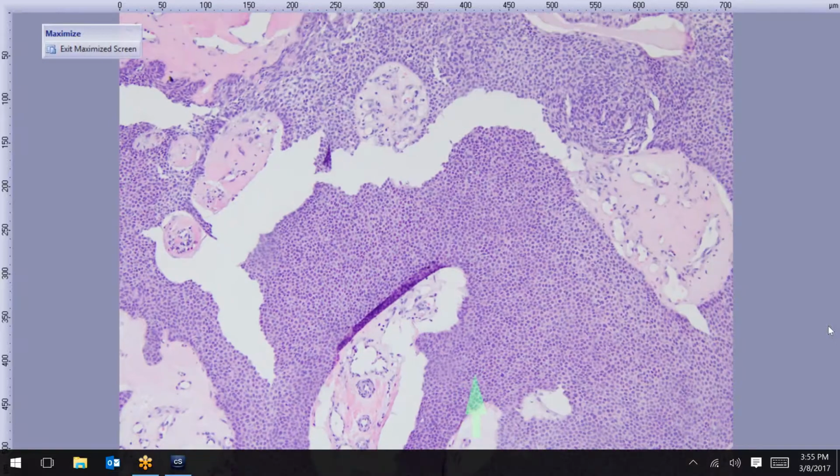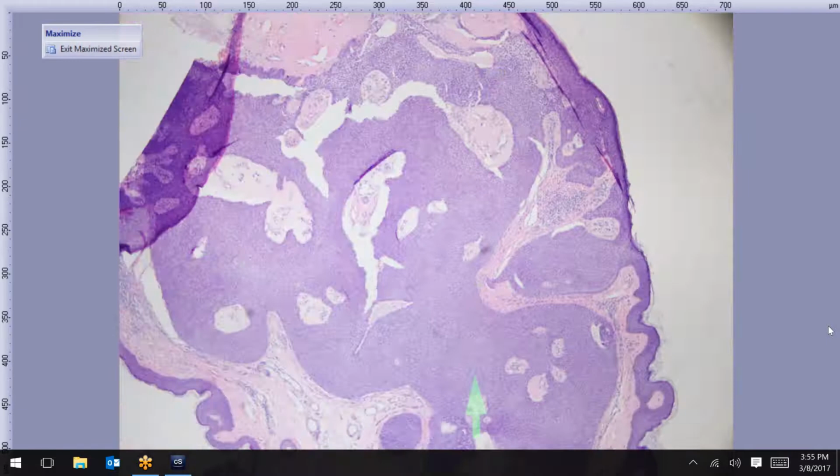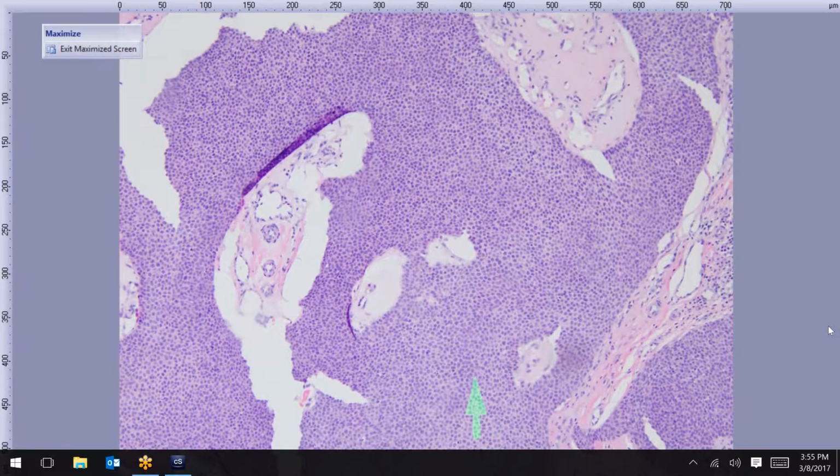I think the other textbook nomenclature would also call this a juxtaepidermal poroma. And then the comment was more like boroma. You are correct. That's a nice way. I've never heard that one actually before. But yeah, the cells are so similar. They're boring. I love it.